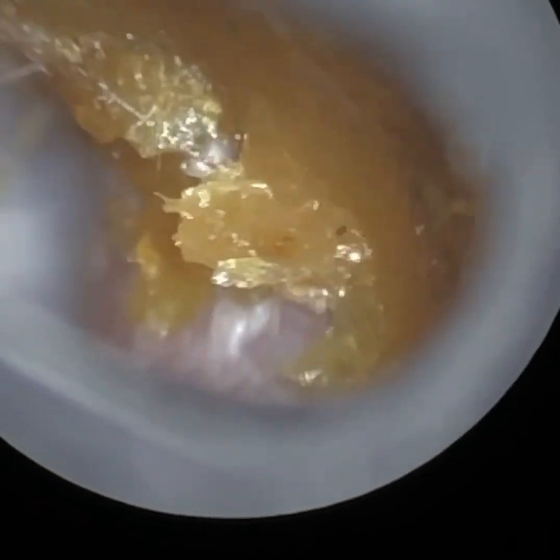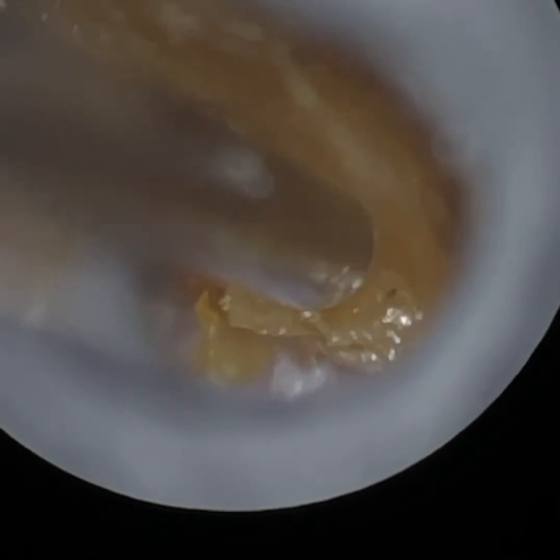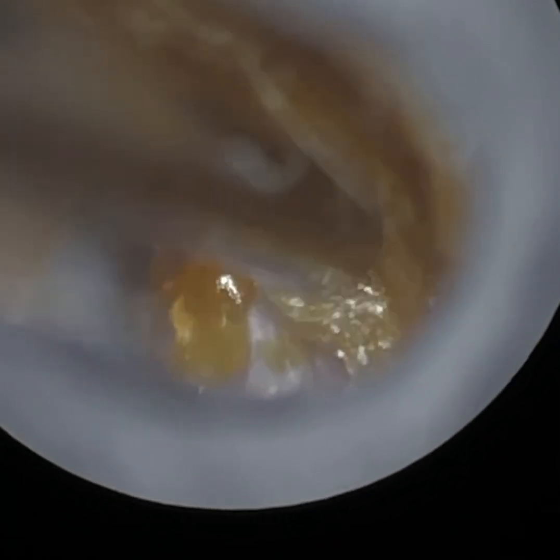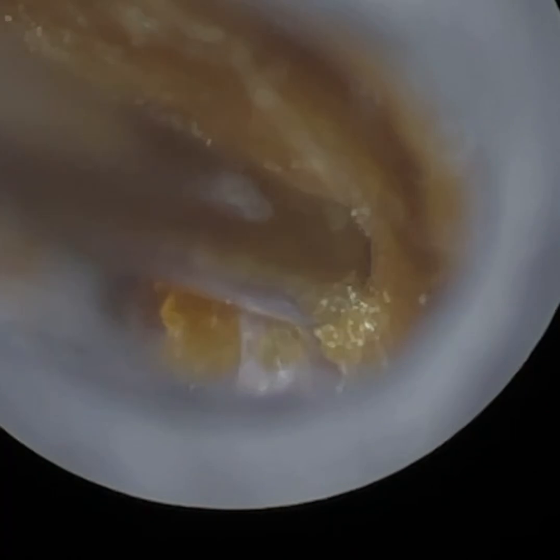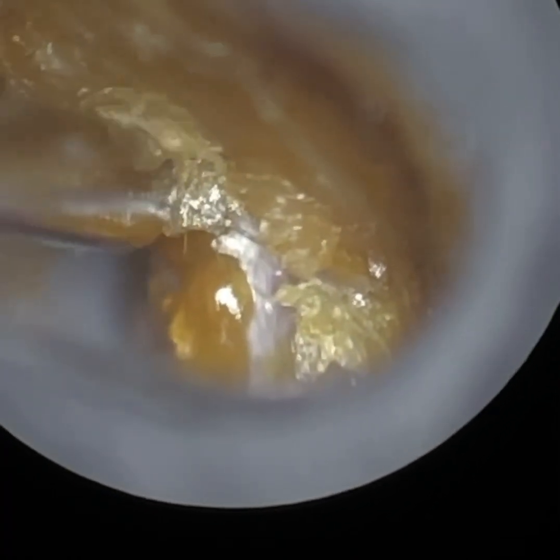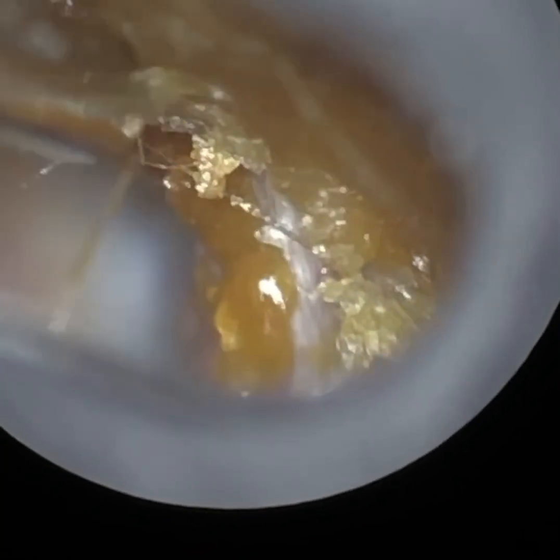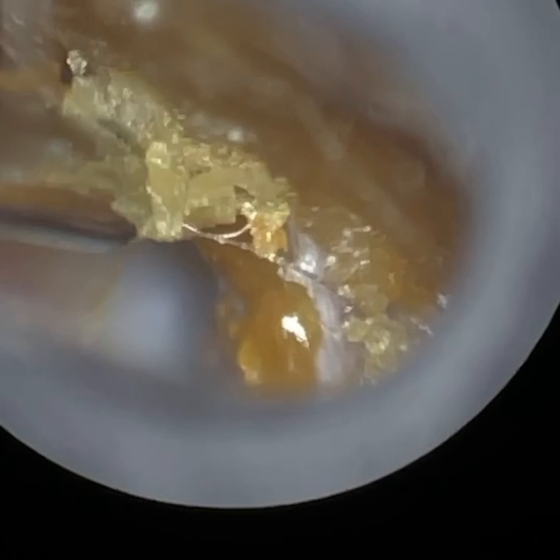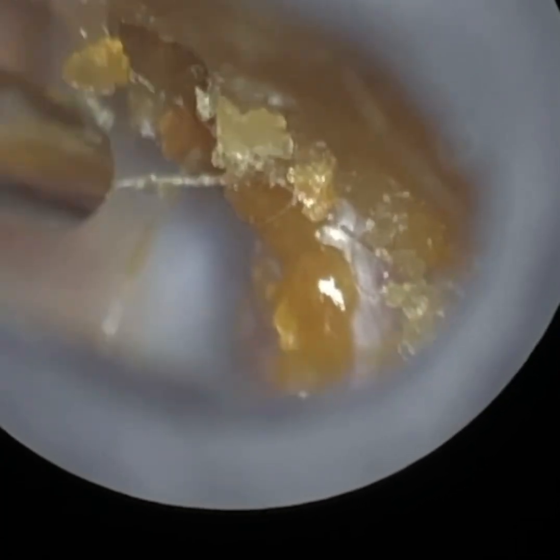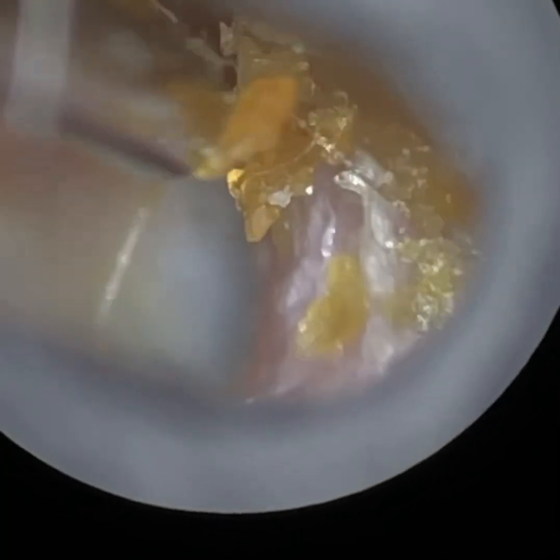The other day at the clinic we had almost like a technology day. We were comparing all the technology available in the market for earwax removal — the iClearscope operating into your microscope, a very good pair of loops, and some other technologies as well. I've got loops and a microscope, and some people I know brought in another device, and I just gave them a demonstration of the iClearscope and the Waxscope.